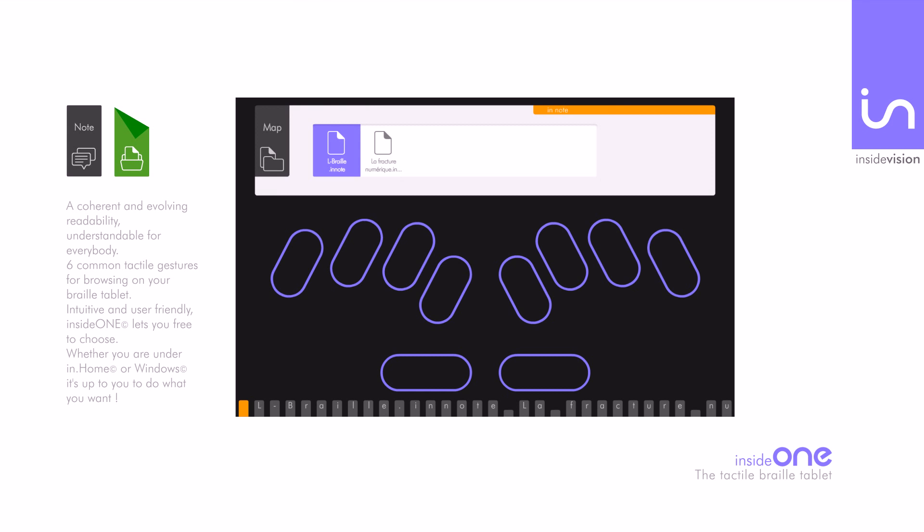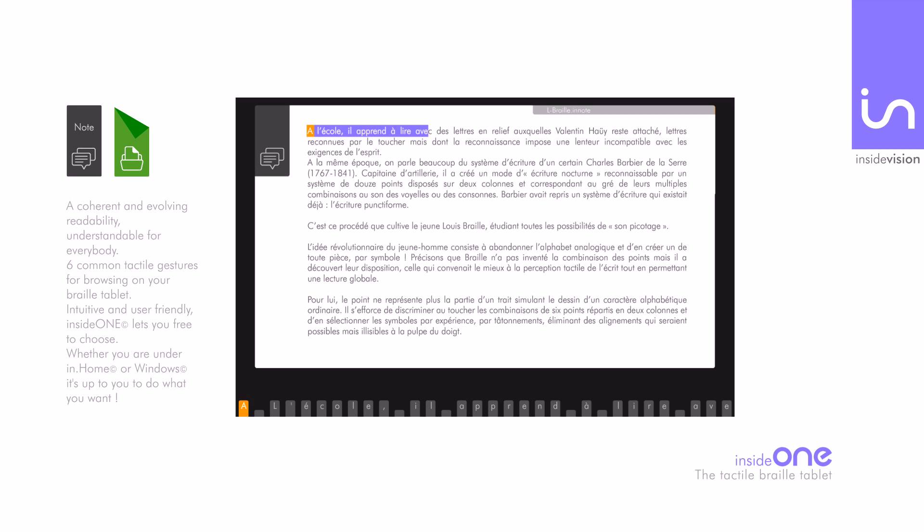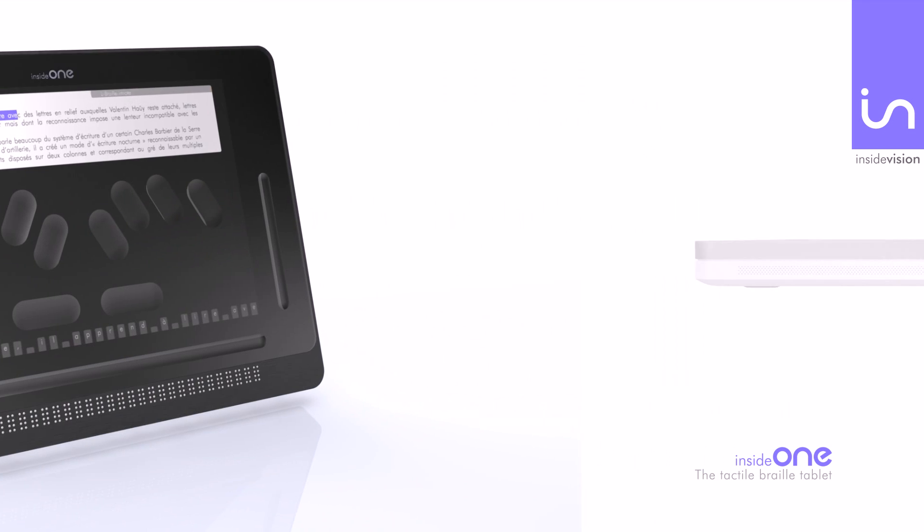Six common tactile gestures help you browse on your braille tablet. Intuitive and user-friendly, InsideOne lets you free to choose. Whether you are under InHome or Windows, it's up to you to do what you want to do.